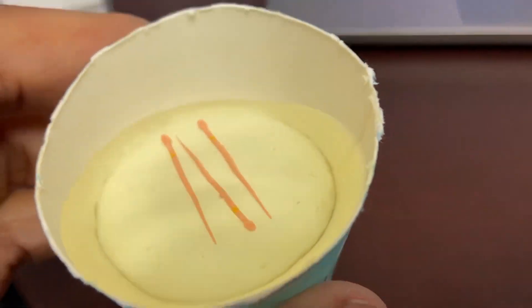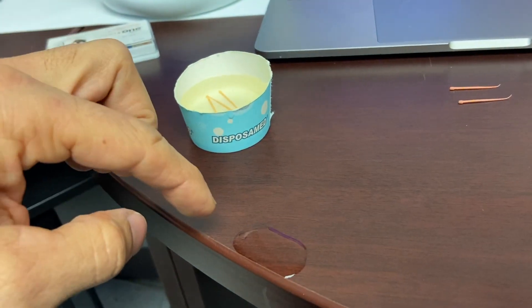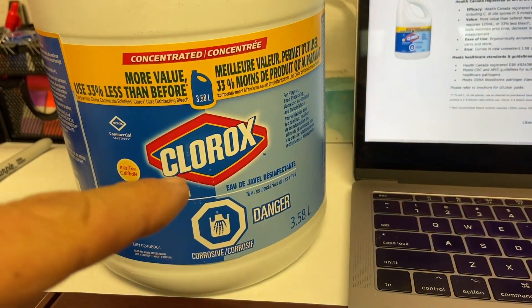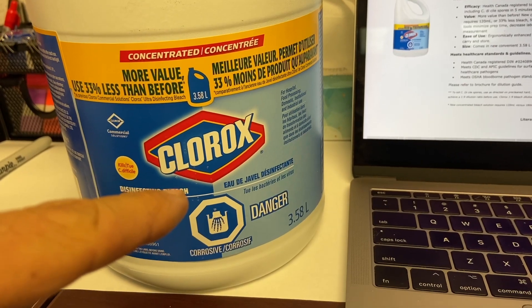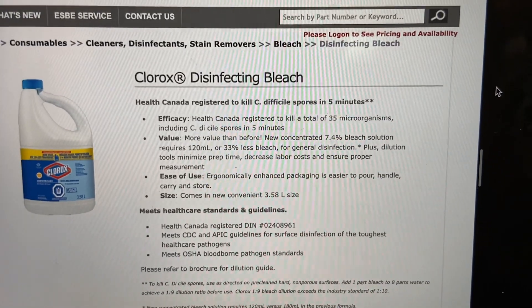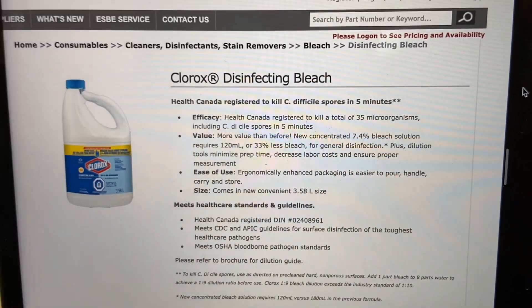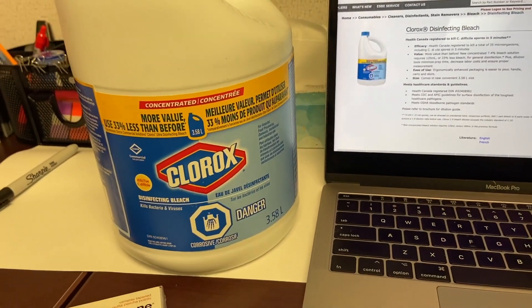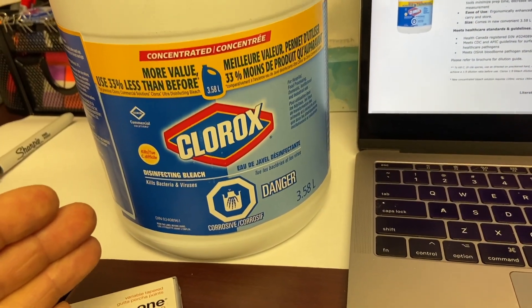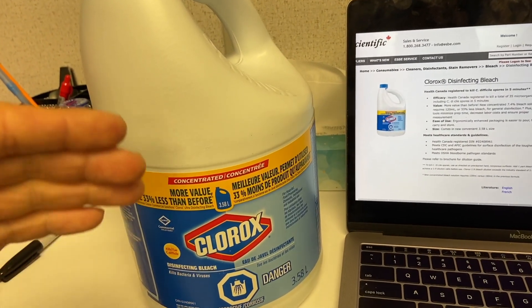I had a long drone-on video prep, but I just spilled some. In preparation for this video, I was thinking: what is the percentage or the concentration of this bleach? I thought it was 5.25%, but it's actually 7.4%. So at the end of the day, you've got to check to make sure you know exactly the percentage of hypochlorite you're using. And if it's expired — the reason it's in this white container is because it will break down with light.